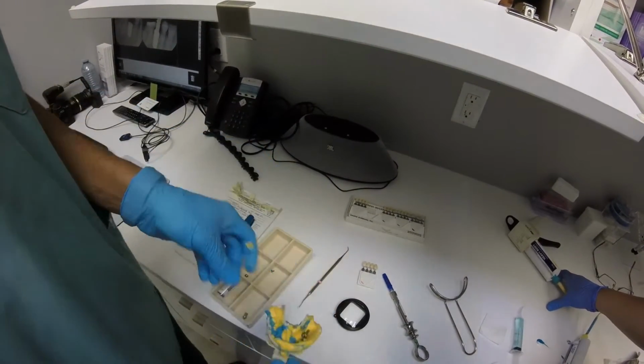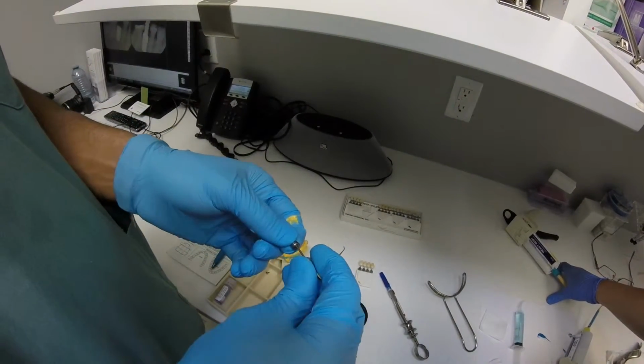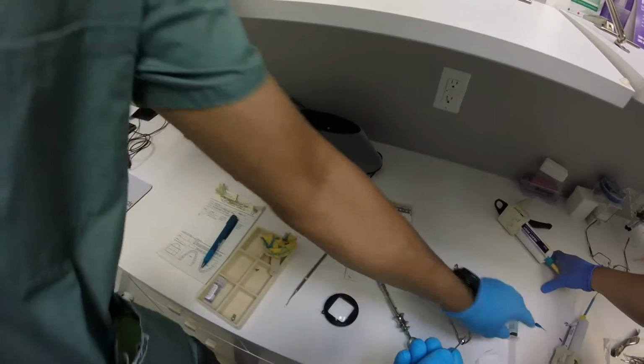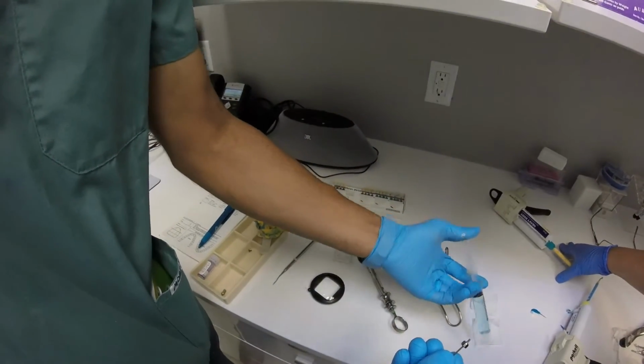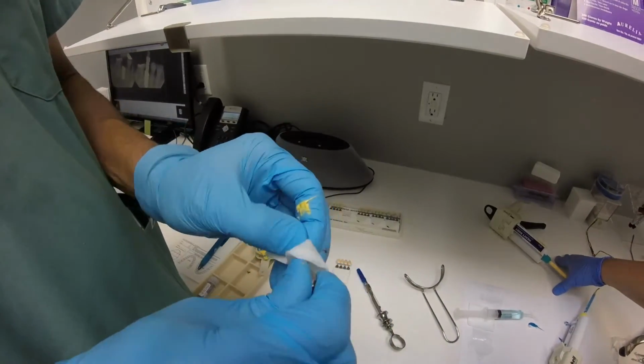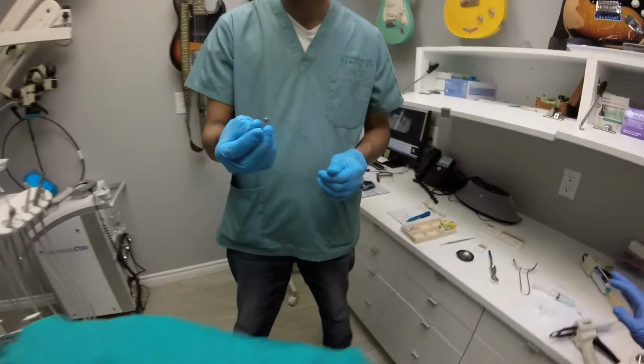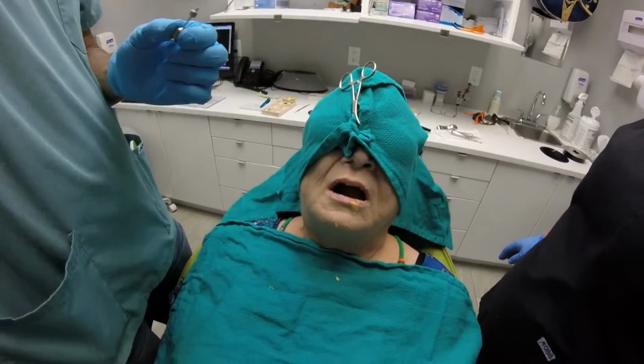So now what I'm doing is I'm grabbing a healing abutment, and what we're going to do is basically irrigate a piece of gauze with some chlorhexidine. You can also use the 0.25% sodium hypochlorite solution just to detoxify these things. It's also good to take towards the tissue. You don't want blood and stuff that's going to be sort of sitting on top of that implant face. That's going to, when you close it up, it's going to necrose.